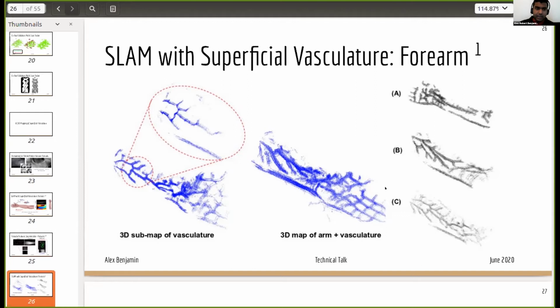So that's generally, up until this point, basically, can we reconstruct volumes of organs, and can we account for one of the major pitfalls in the clinical setting, which is patient motion.